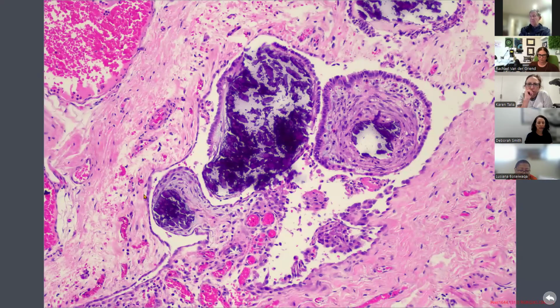Epithelium sitting up the top here, but with mesothelial stroma running around the background. So you know that you're sitting on the surface and not invading. And so for me that highlighted the importance of knowing where you are in the ovary, and the importance of that rule in the WHO, about 10% only relating to something that's inside, that's intracystic.